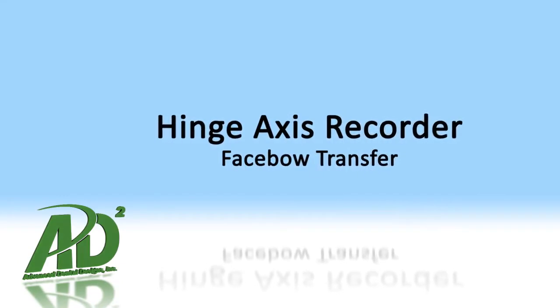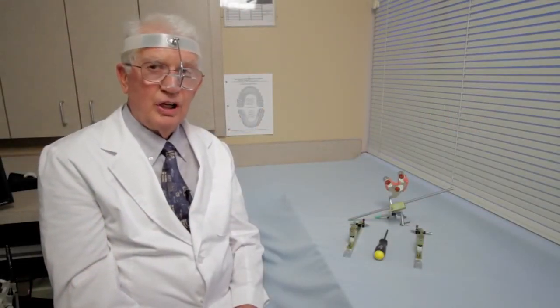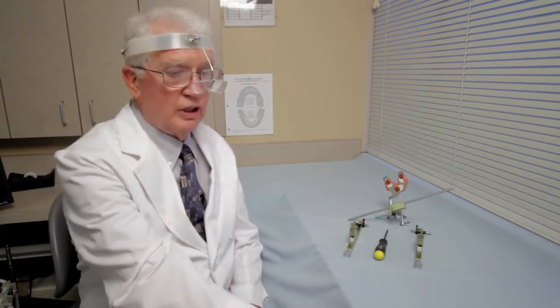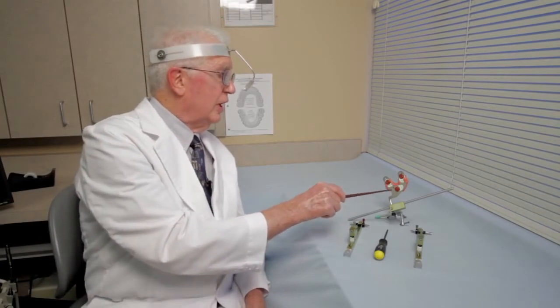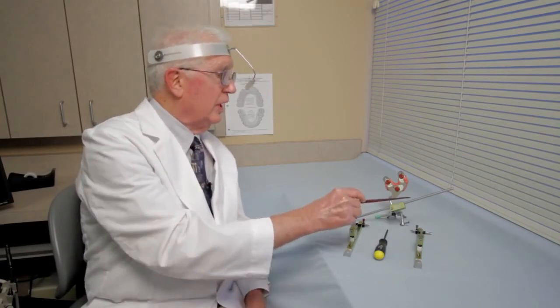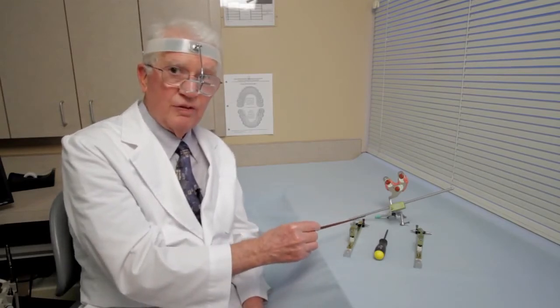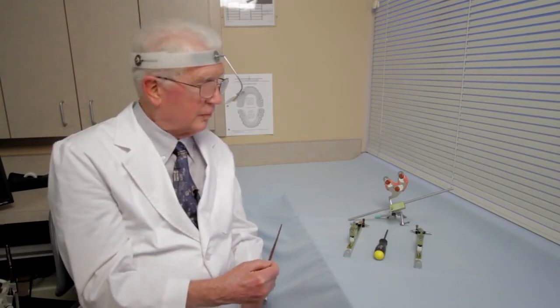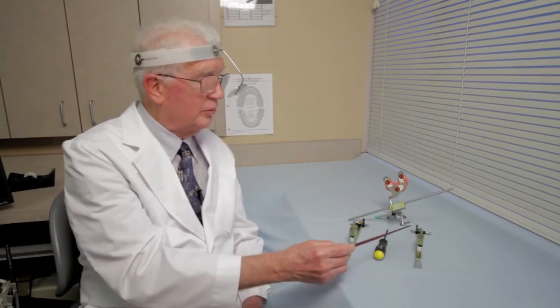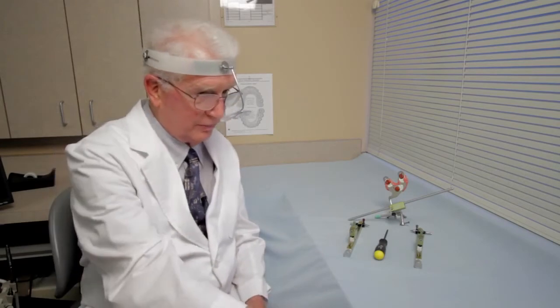We're now ready to do our hinge axis facebow transfer. I want to point out to you the instrumentation that we'll need to do the hinge axis facebow transfer. We'll use the bite fork assembly and this crossbar that you saw when we did our estimated facebow, or our anatomical facebow, and then we'll use the two side arms that we used when we did our hinge axis recording, and we'll need the hex wrench to tighten these two side arms.